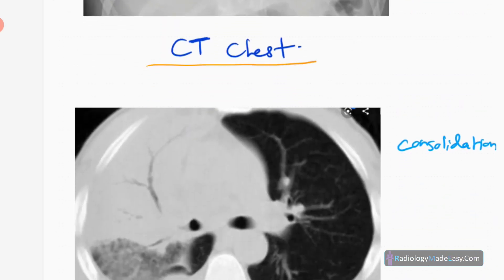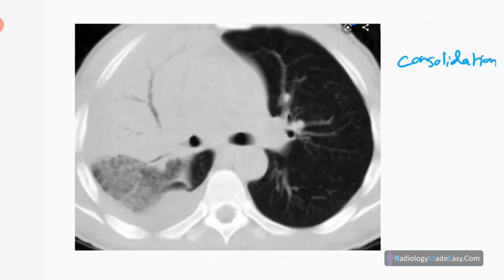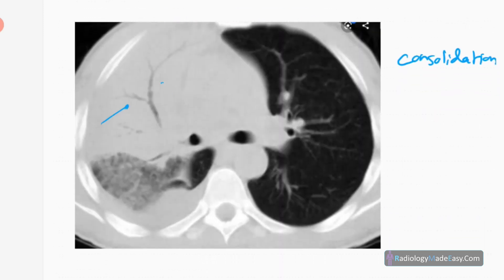Now we discuss CT and HRCT. On contrast CT chest, you can see bronchogram formations — a consolidated area in the upper lobe with a nice ground-glass appearance and pleural effusion. You can see air-space opacification with air bronchogram formation. The left upper lobe is normal. This is a contrast-enhanced CT.